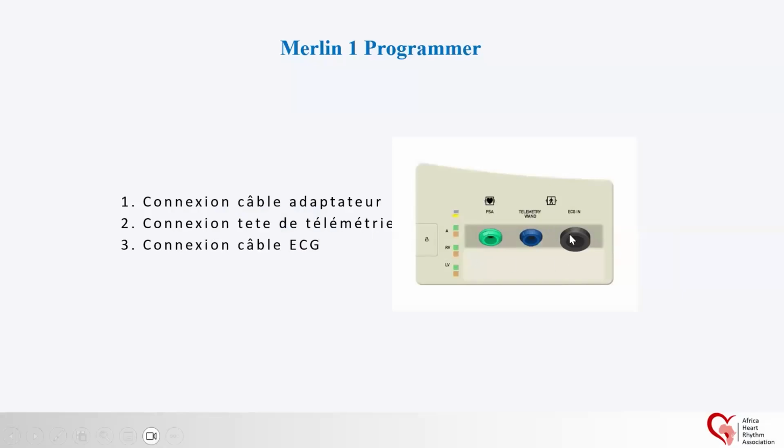We have also a connection of ECG that we can use. In this programmer, we can use ECG during implantation or during follow-up. So that avoids using an external ECG. We can use this connection for a cable of ECG.